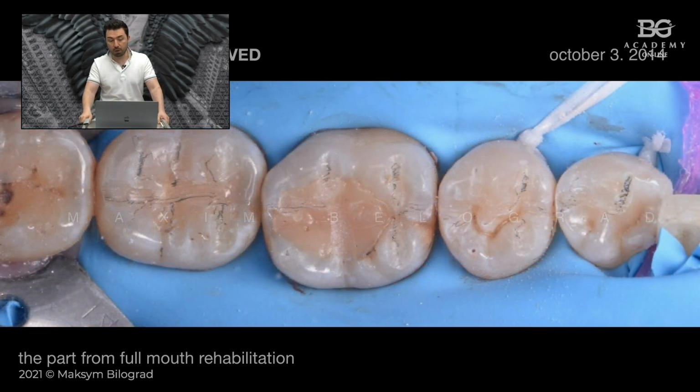Okay, so afterwards we can remove the mock-up and we exactly see how far we went into the teeth of our patient. In this case, you can see we are pretty conservative because we have the possibility to add posterior teeth in such a case.